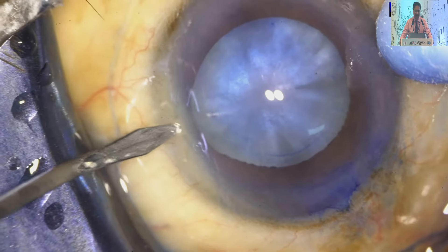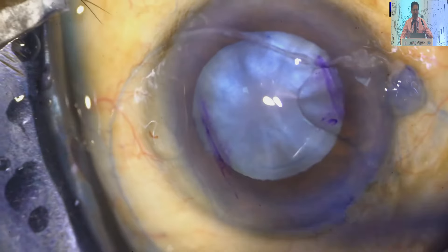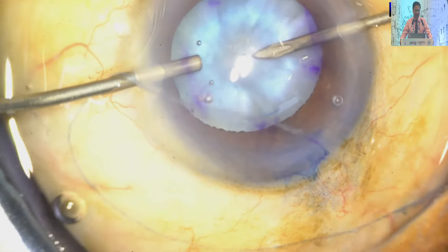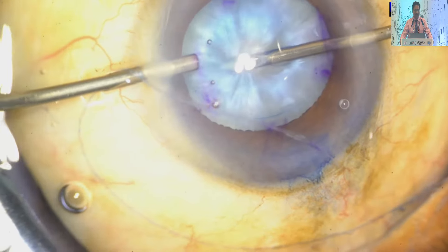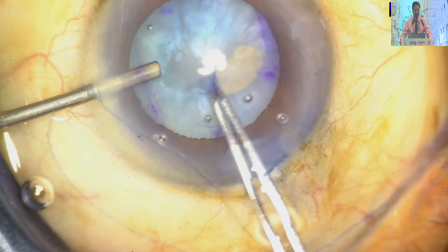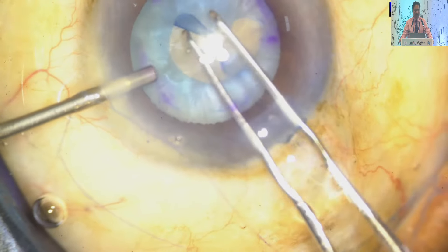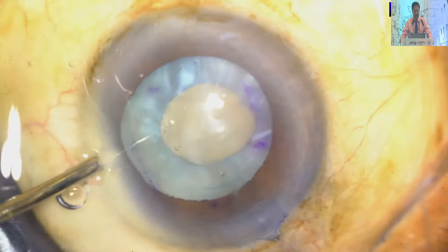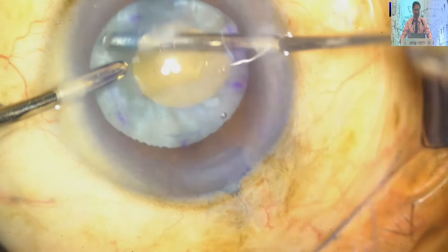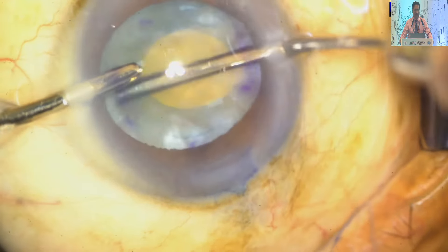Again, two simultaneous incisions. The important point is that simultaneously you are aspirating as well as pouring the viscoelastic inside the anterior chamber from the other end. This is the aspiration with the needle — at the same time you are pouring visco from the other end. I have also developed an automated technique of visco delivery, but one can also use manual visco delivery. This is the small capsulorhexis I have made, and then I have aspirated and decompressed the capsular bag so that there will not be any Argentina flag sign.